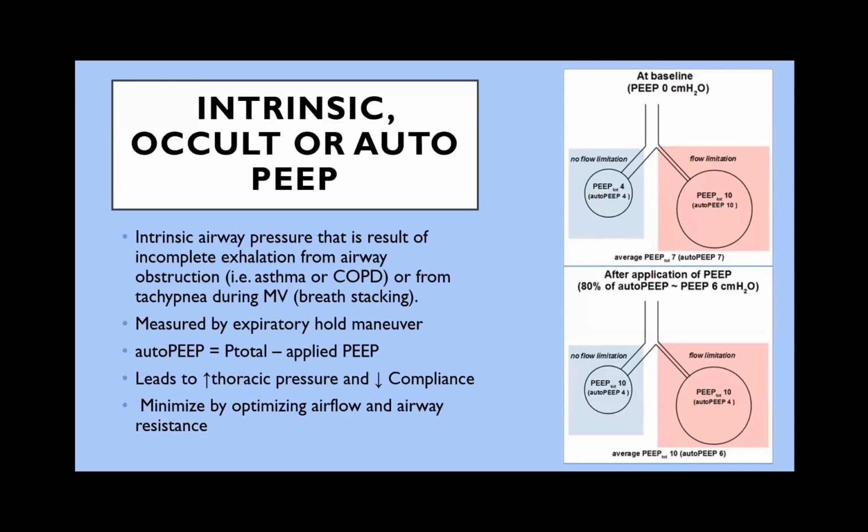And it happens every single time when there's an asthmatic. Sometimes for an asthmatic, a rate of 16 is too much. So these asthmatics are often going to require even rates of 6 to 8 breaths per minute to actually be able to breathe out all of the air.